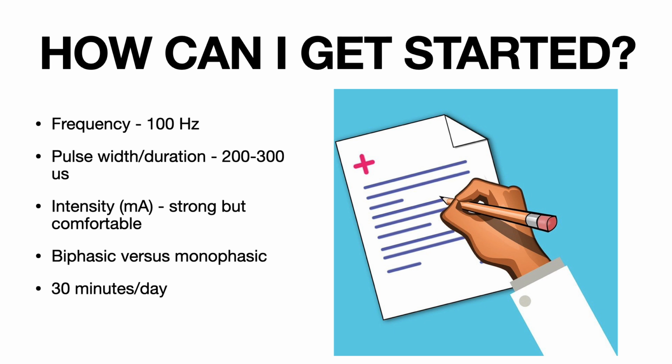And often the reduction in tone lasts anywhere from an hour to slightly longer, which can be great as it may allow you, in that window of time, to do things that you might not have otherwise been able to do because your tone is often problematic.